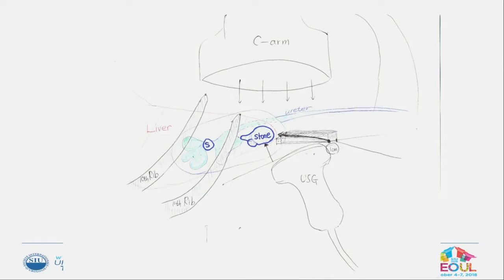So the most important thing is, there are two renal stones, in the lower pole and the mid pole. And when I checked the mid pole stone, it was in the mid pole calyx, but it's not freely movable. So I think I need to use the flexible ureteroscope after I remove the lower pole stones using the percutaneous nephroscope. Okay. And another important thing is the liver is overriding the right kidney.